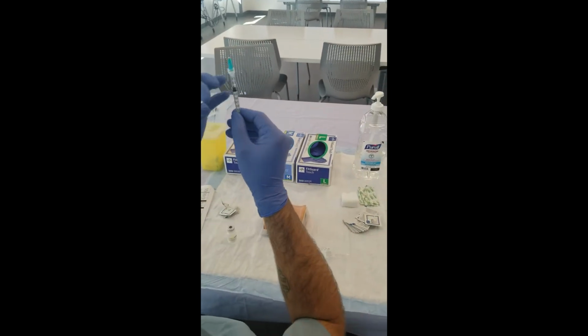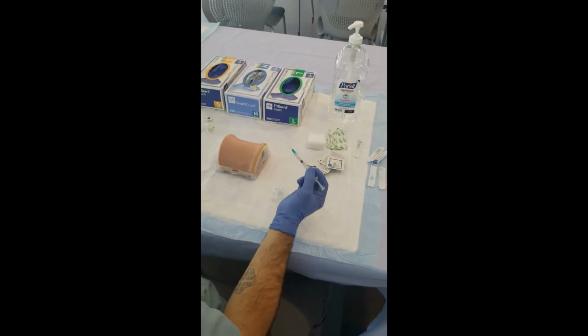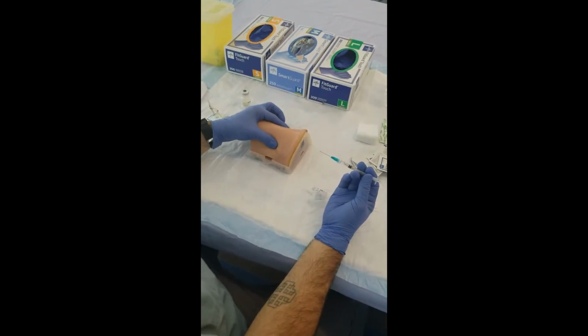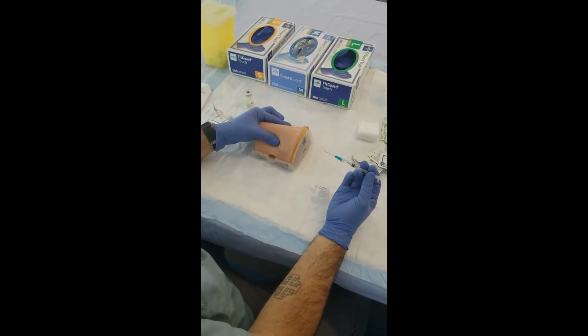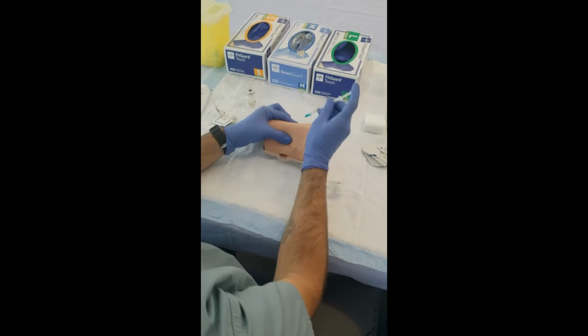Step 23. Held tissue gently between thumb and forefinger to raise subcutaneous tissue above the muscle. Step 24. Inserted needle at a 45-degree angle and injected fluid.